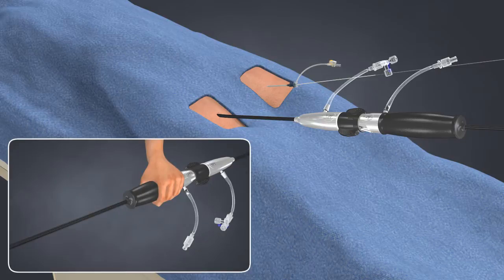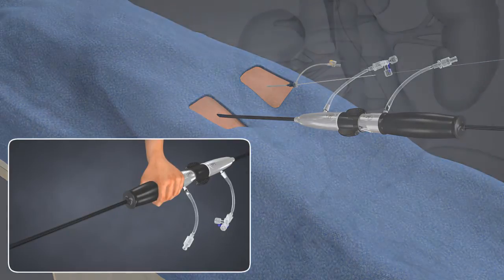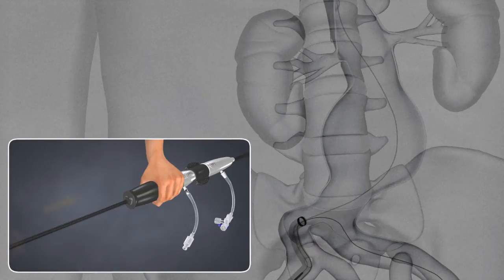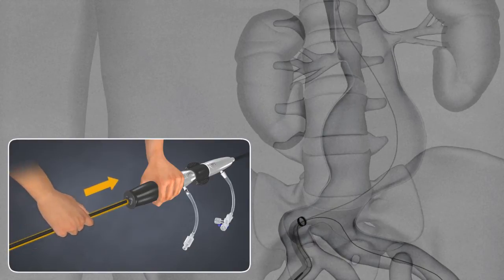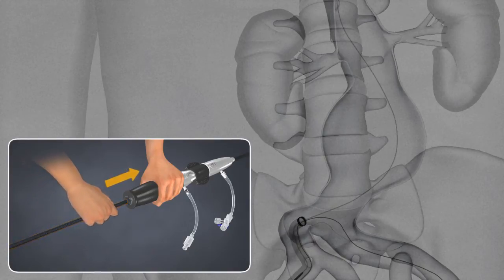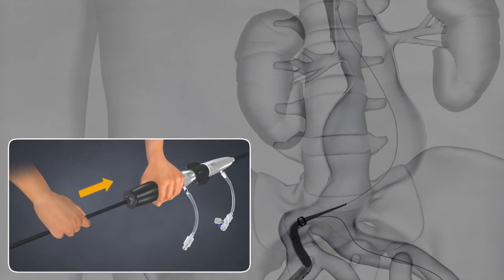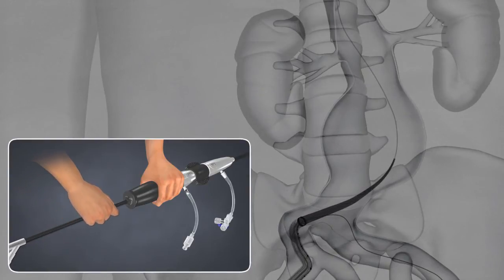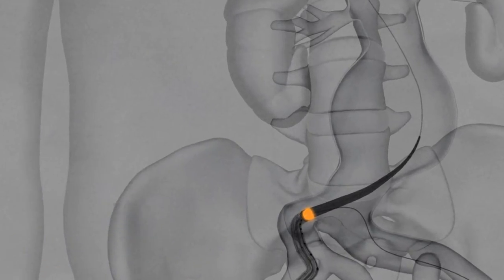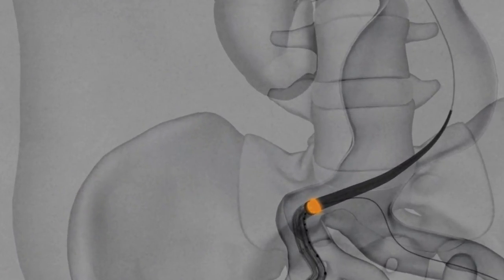Keeping the bifurcated delivery system handle stationary, advance the inner core under fluoro. This motion advances the bifurcated stent graft through the introducer sheath. Continue to advance the inner core until the base of the radiopaque tip is aligned with the RO marker band of the introducer sheath.